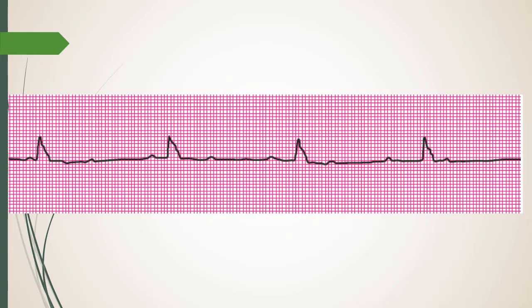Technically it should respond to the junctional foci, atrial foci, or SA node — so you'd hope to see some relationship. To confirm there's no relationship, I find two P waves with nothing between them to hide anything, put them together using the corner of the paper to where my finger is, mark it out — and it matches, matches, matches.